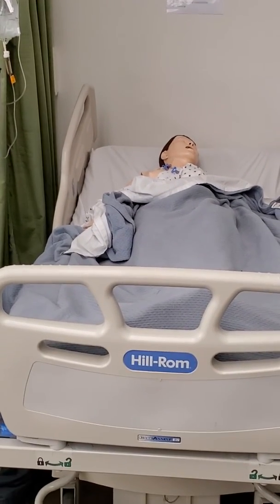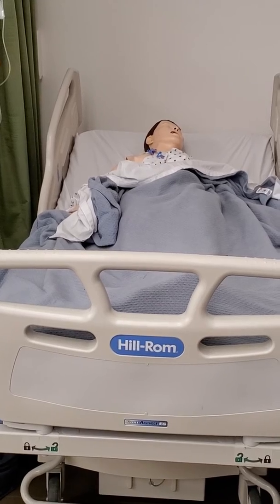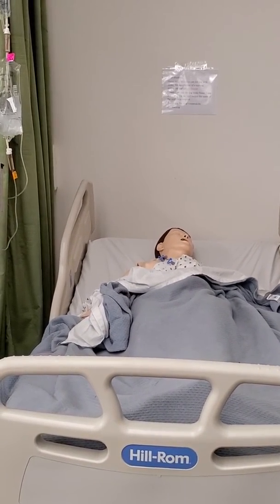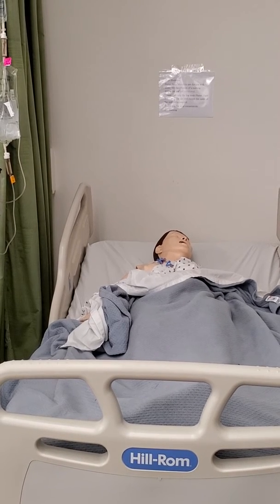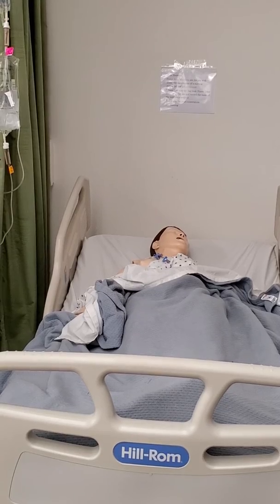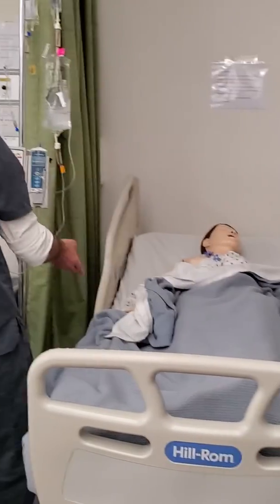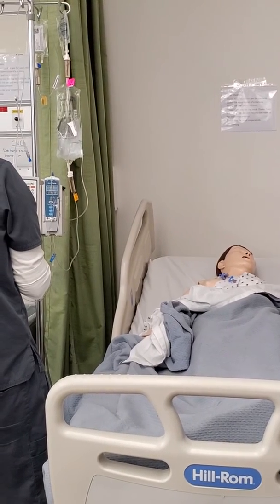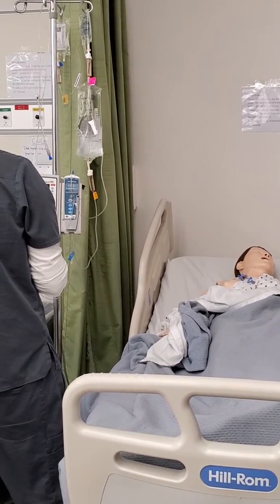Okay, so before spiking the bag, I'm gonna check on the MAR the medication, and I have 1 gram in 100 milliliters of Ancef. I have it on my MAR. This is for Jane Tripp. I have the expiration date, November 19th, 2019.